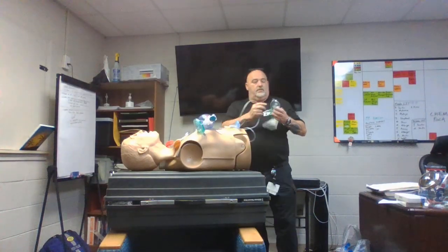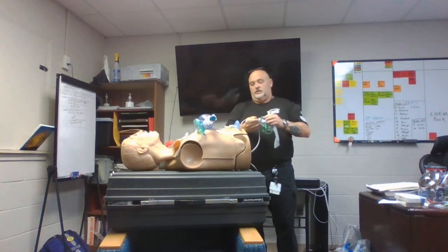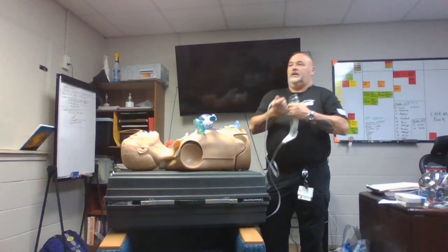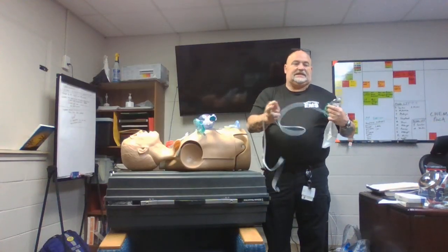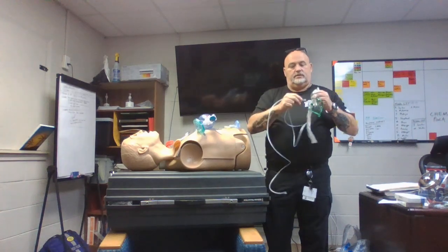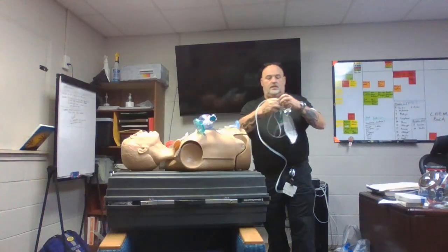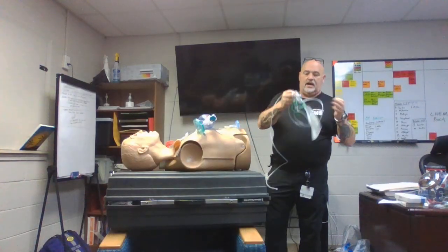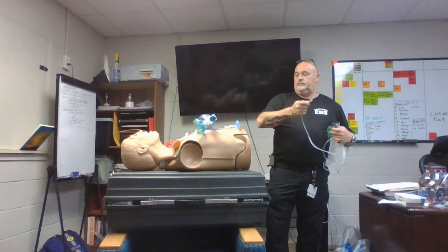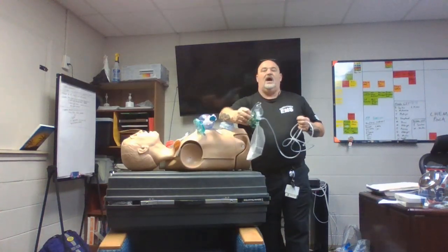Non-rebreathers, right? We touched on the neb mask briefly, but I said we're not going to use those. Why? Because I think that's more of getting into airway management for specific causes, right? Non-rebreathers. They assemble quickly, right? You got the mask, the reservoir bag, and the tubing that goes to your O2 tank. What's the flow rate and why?